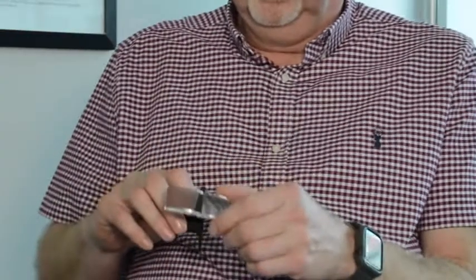Yeah. And don't forget you need to think about how wide the field is that you're looking at. So if you've got a problem with central vision, you need something with a pretty wide field, or you need to start being able to look through it a bit eccentrically. So you've got another piece of kit on the table there that looks like it clips onto your glasses.